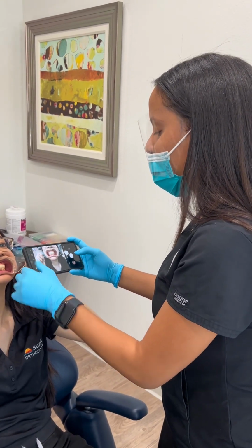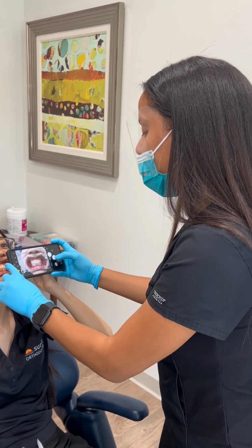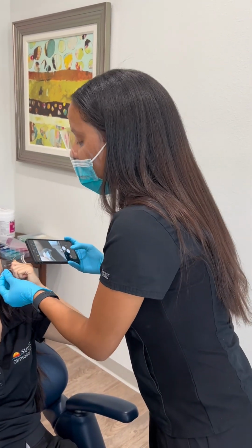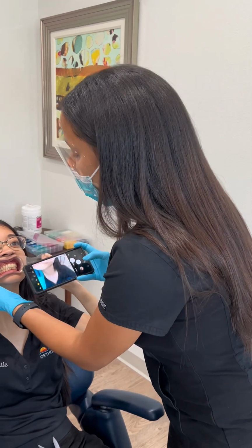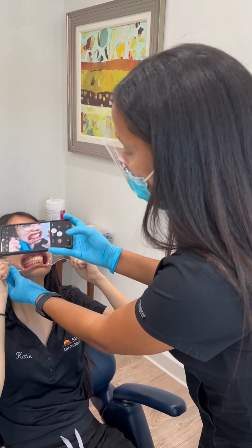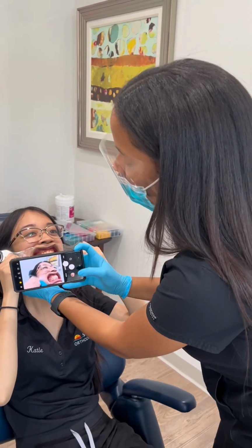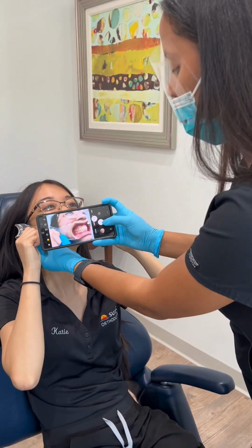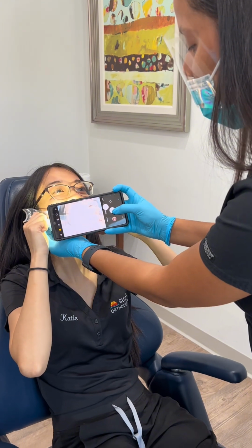You always want to have the flash on if you're in a dark room, because these initial pictures are going to be important. Then you're going to loosen up on this side and pull more on this side. And you don't want the camera to be facing down, and you don't want the camera to be facing too high. You want it to be just right parallel to get a good shot of the bite.